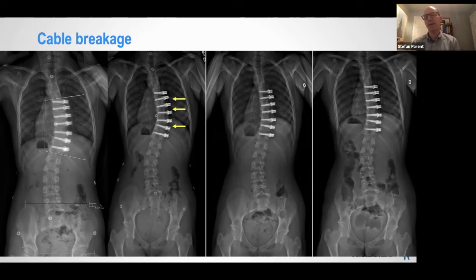So I said, okay, back then we were maybe 2 years into doing this at my institution. I sat down with her again. I said, well, if this is going where I think it is going, with 3 cable breakages, we'll rapidly go back where we stand. So why don't we go back and do it again? So she is now 7 years out and she's under 10 degrees. That's not her last film. I saw her last film.